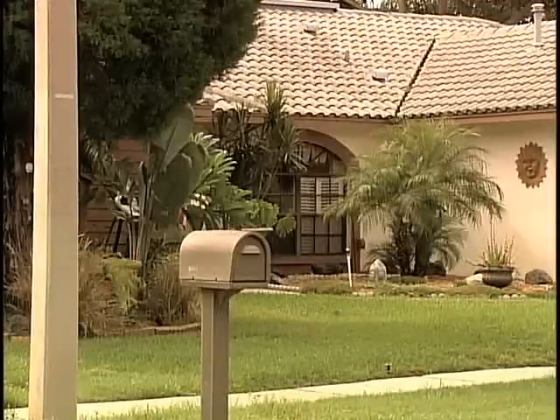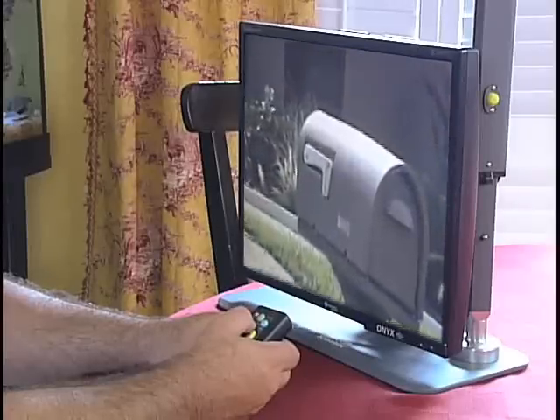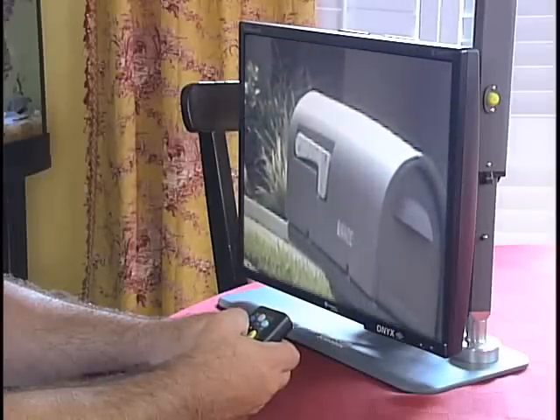For example, I can't just look out the window and see my mailbox, but with my Onyx desk set I can easily zoom right in on it and see if the flag is up or down.